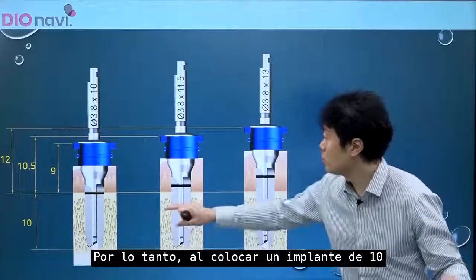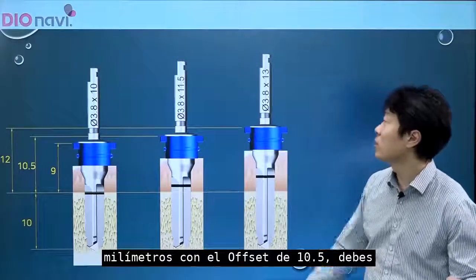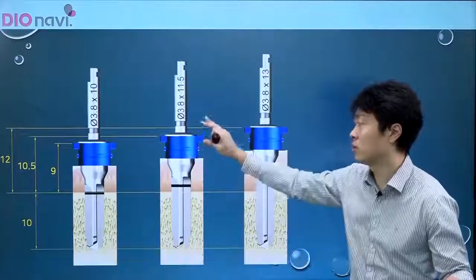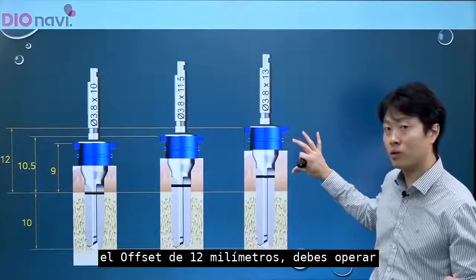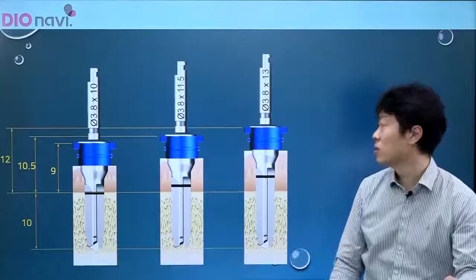So when placing an implant of 10 millimeters with the 10.5 millimeter offset, you should drill with the one marked 11.5 millimeters. When placing an implant of 10 millimeters with the 12 millimeter offset, you should operate with the drill marked 13 millimeters.